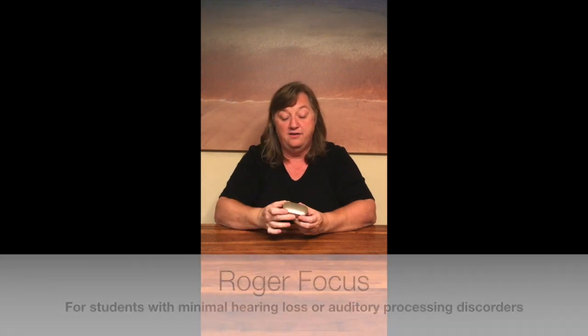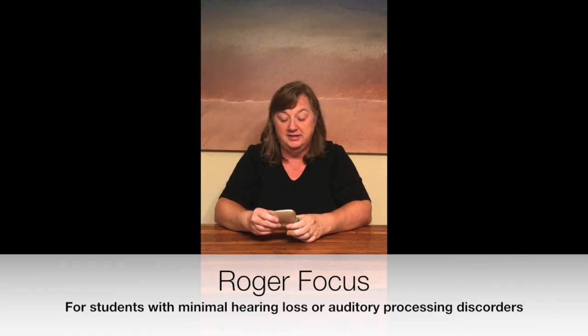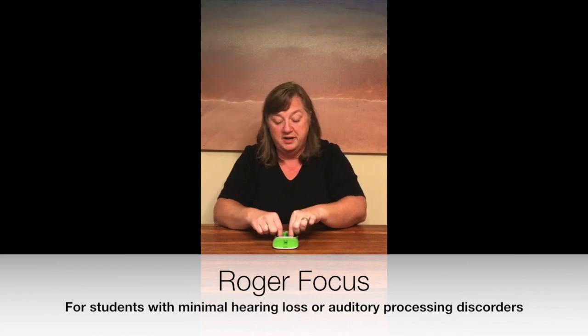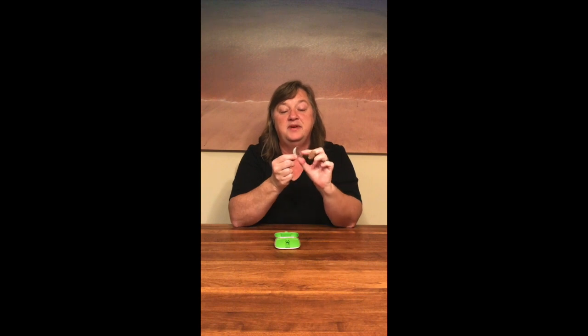One of the receivers we have in district is called a Roger Focus and it comes in a little case like this. Your student might have one or two of these depending on their hearing needs. If you open it up you'll find inside a little device that looks very much like a hearing aid. It has a tip that is inserted into the ear canal and it has a body that goes behind the ear.